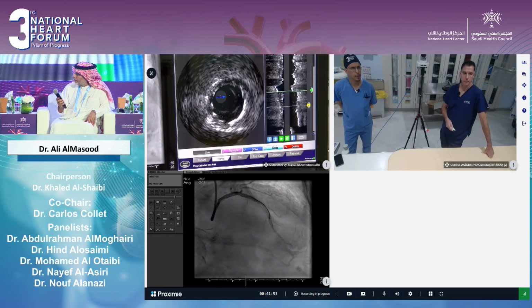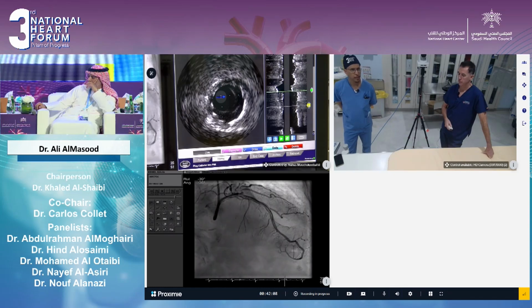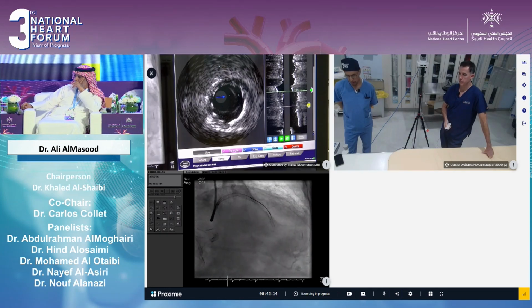At this stage, the patient's pain subsided with the kissing balloon and the NC balloon, and on the last IVUS run we were happy with the areas of the mid proximal and left main, and we decided just to stop at that stage. Yes. Any questions or comments?